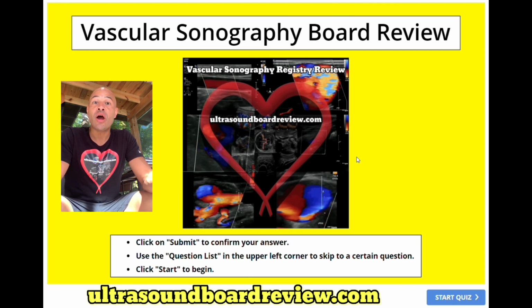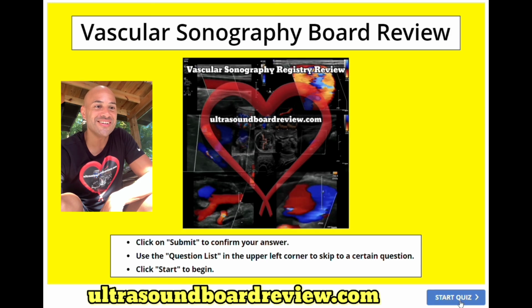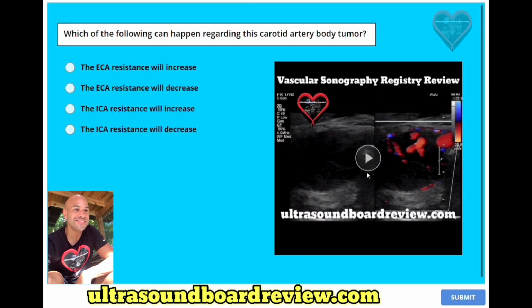Feel free to pause the video after I ask the question, to give yourself enough time to answer it before I answer it. Let's get started. Question number 1.